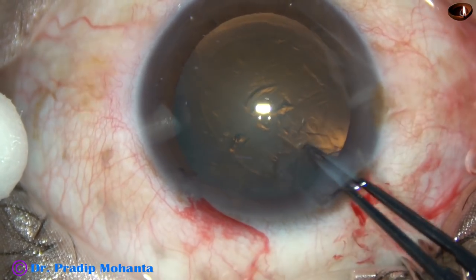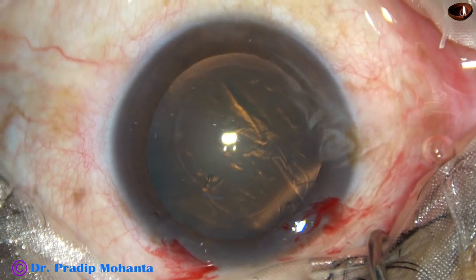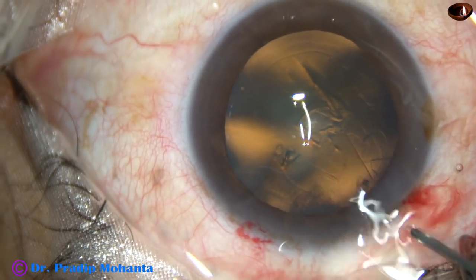And do a continuous curvilinear capsular rhexis. As the rhexis tended to become small, before completing the CCC, I have enlarged it by going to the periphery a bit.